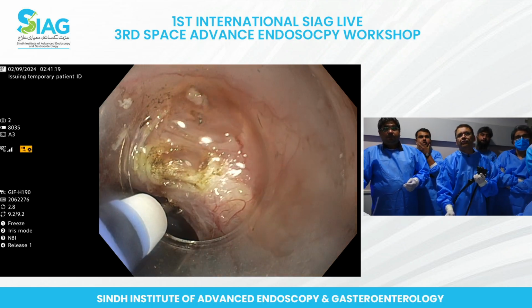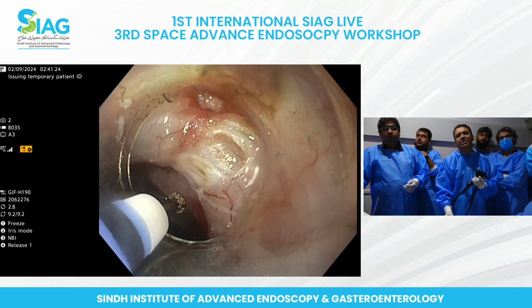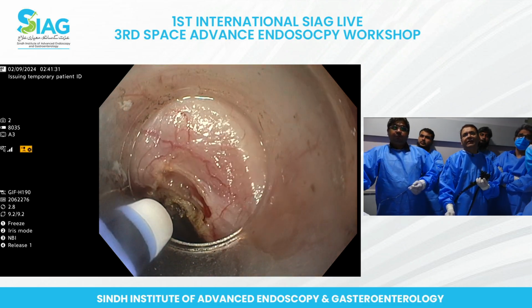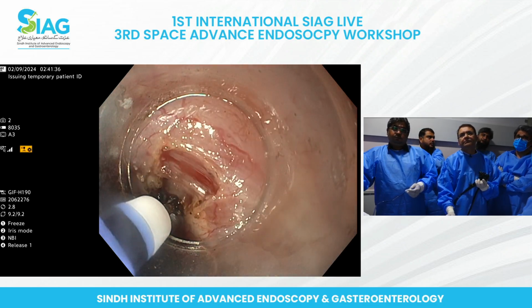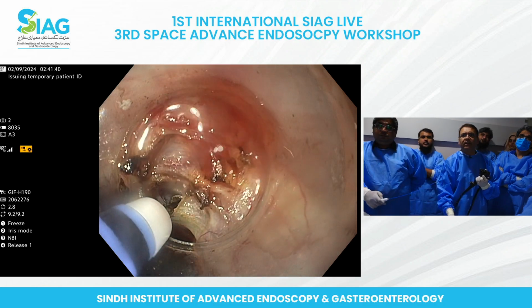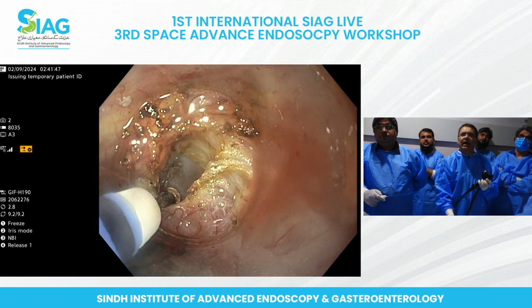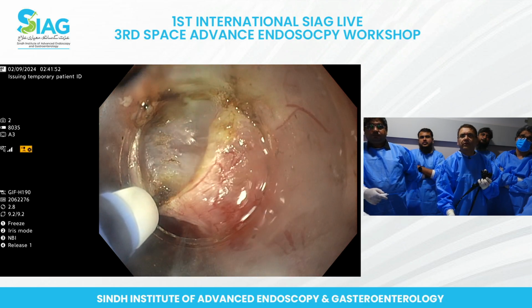So why did you prefer anterior over posterior in this? The majority of my patients I do anterior, because that's how I trained. But is there any difference in terms of results? I think there is not much difference honestly with the results. There is some minor evidence that anterior might have less reflux.